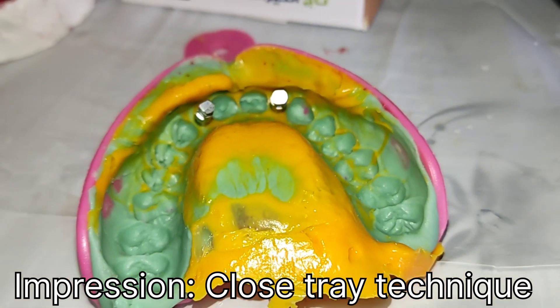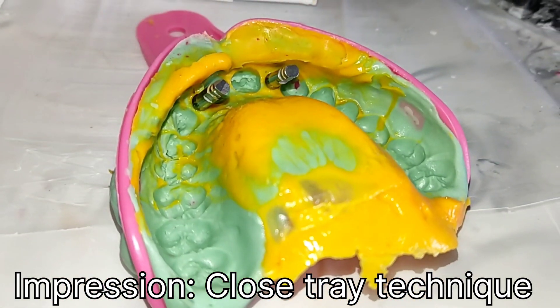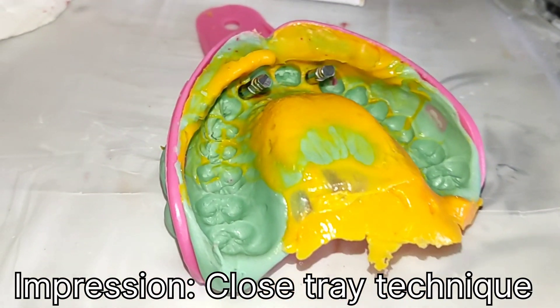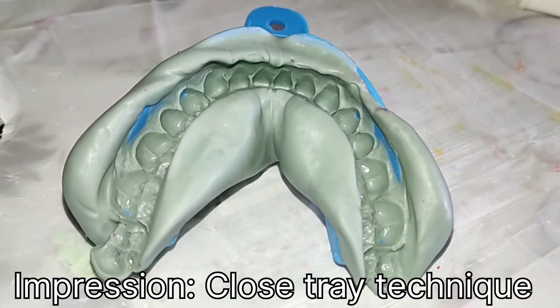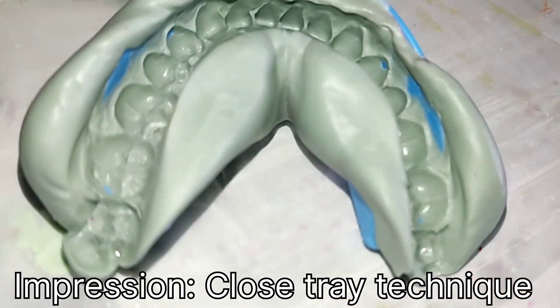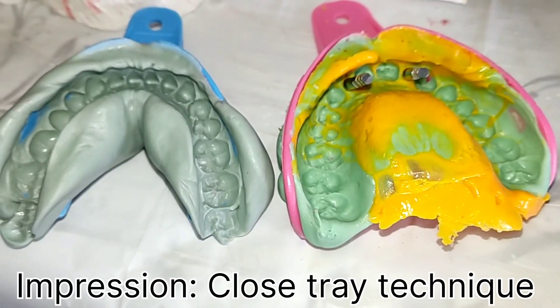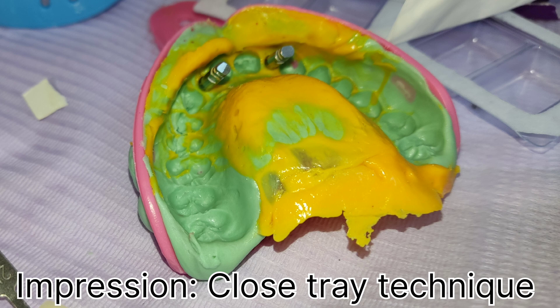Technical features: Level — bone level. Connection type — internal. Connection shape — hexagon. Head shape — straight head. Microthreads — no. Body shape — tapered. Body threads — V-shaped. Apex shape — dome. Apex hole — no hole. Apex grooves — yes.